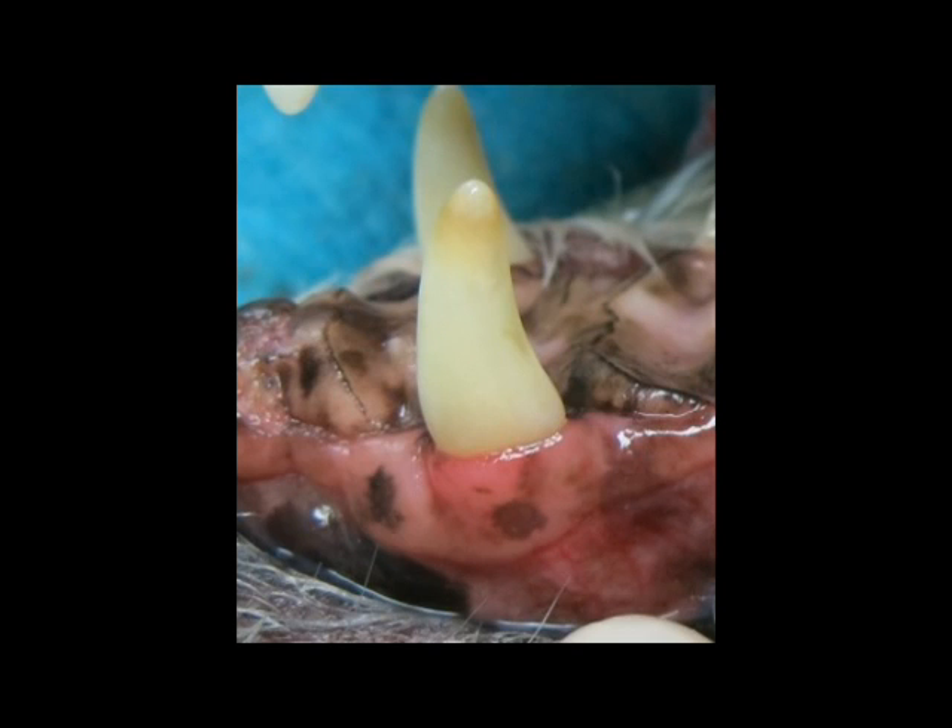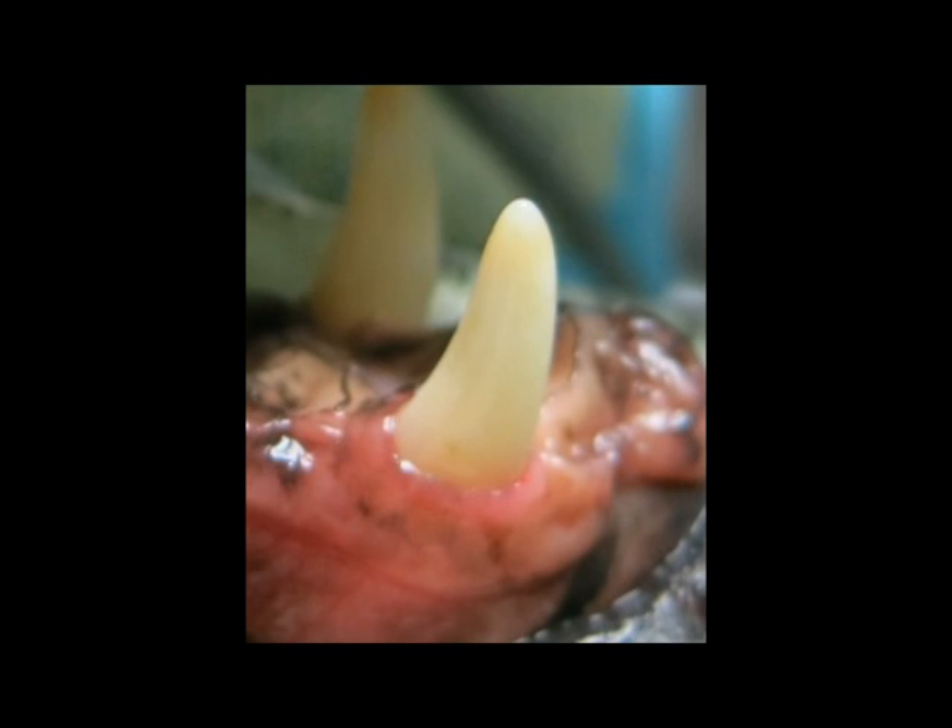Here is the outside surface of the tooth — look how healthy the gums look. The other canine tooth is used for comparison and looks similar, but the bone height is normal so no loss of bone has happened in that tooth. This shows you the degree of gum recession that has happened in the treated tooth. This little dog's owner has done a wonderful job of home care and her little friend has benefited from her vet and her owner's decision to seek advanced treatment for her right upper canine tooth.